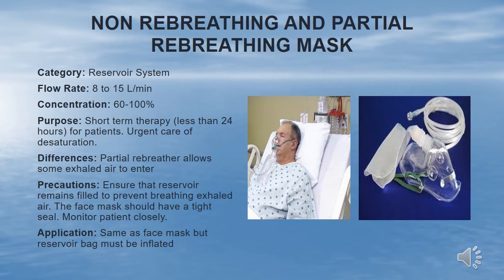The reservoir mask is applied the same as a simple face mask. It is very important to monitor the mask to ensure the reservoir remains inflated and the mask has a snug fit. The patient needing a non or partial rebreathing mask is in a condition which warrants close monitoring, as more advanced treatments may be needed.